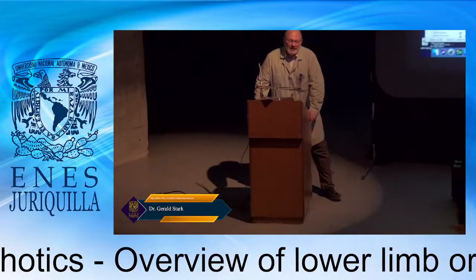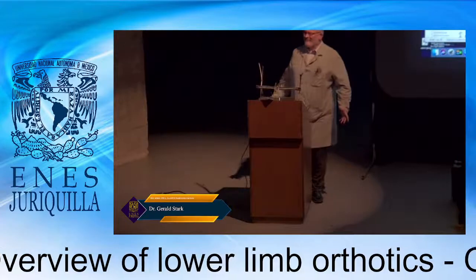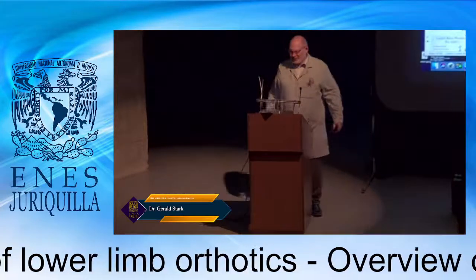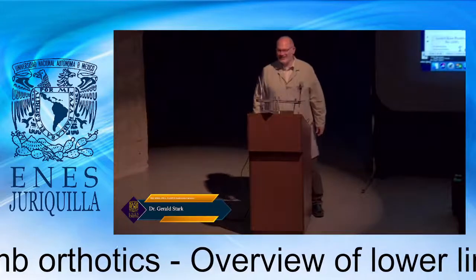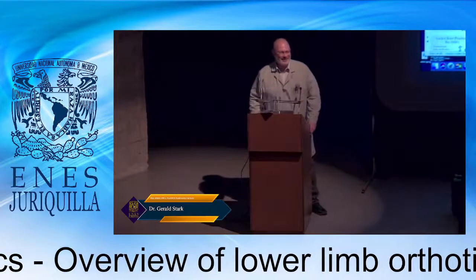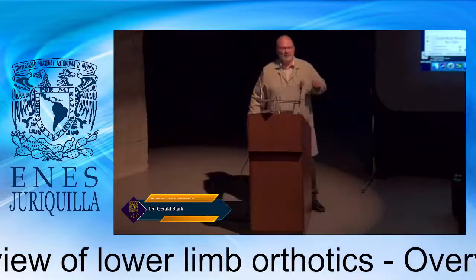The problem is, as with many things in prosthetics and orthotics, the patient has to wear it. It can't just be a science fair project. And when they wear polycentric joints, which have been developed, they tend to pinch the clothes and cause holes in the pants. So if you don't want to buy pants for your patient all the time, they're not advisable. There are not many polycentric joints.